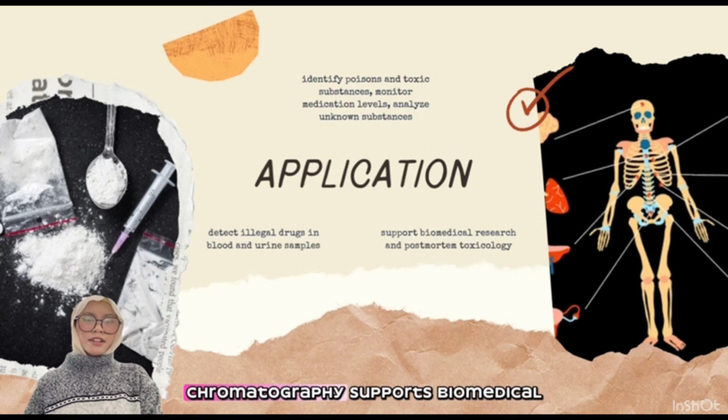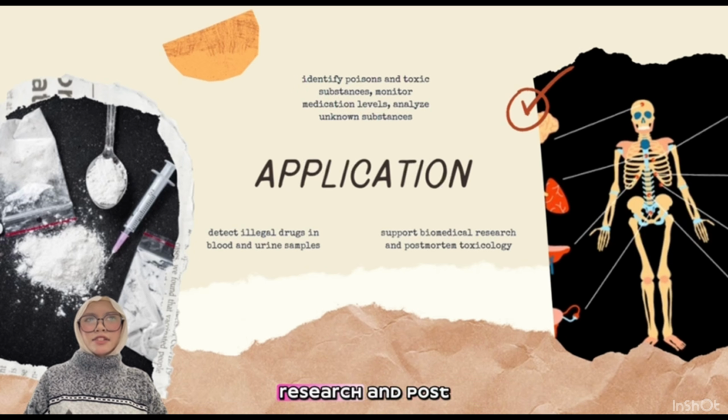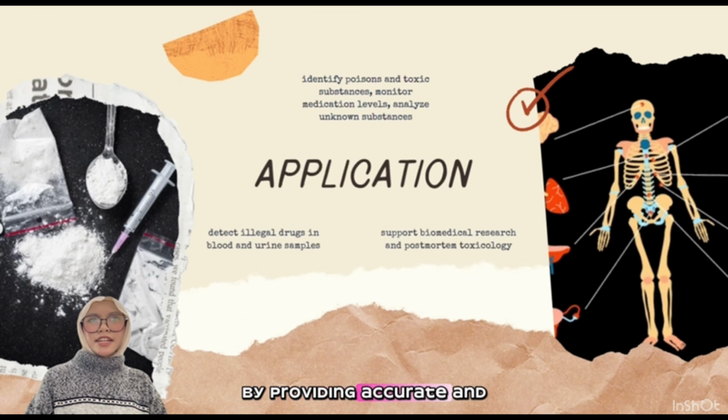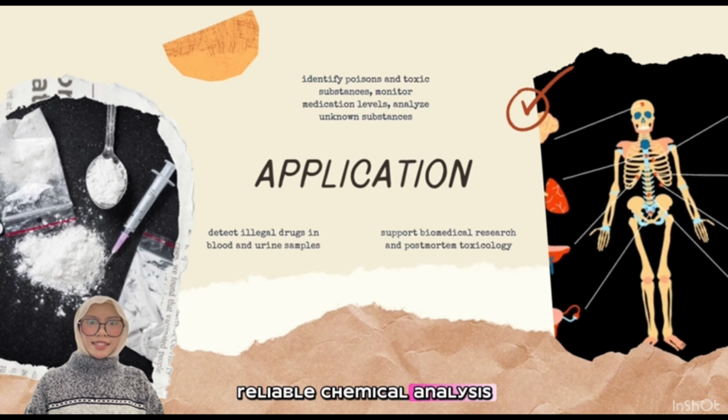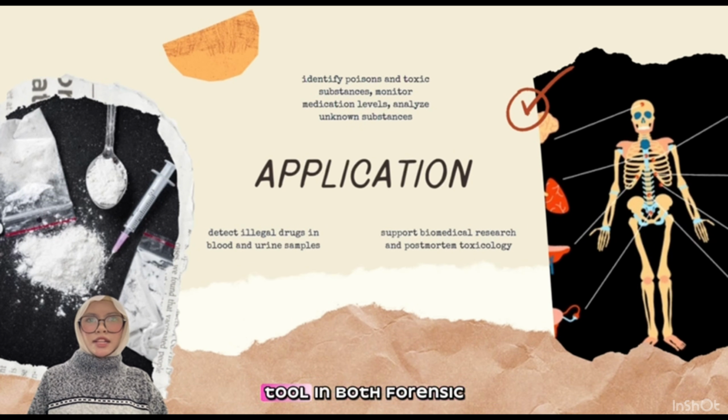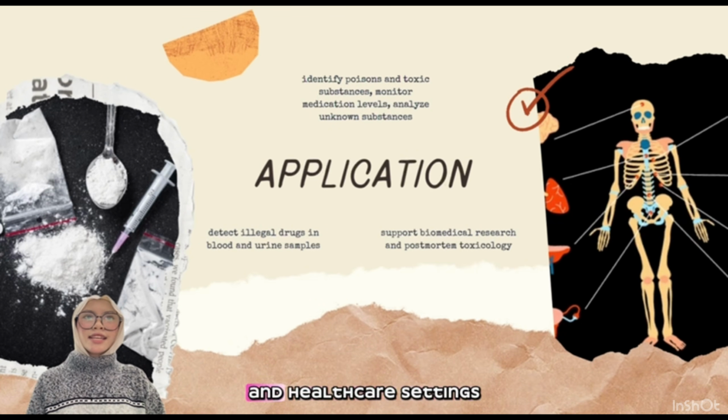In addition, chromatography supports biomedical research and postmortem toxicology by providing accurate and reliable chemical analysis. This application makes chromatography an essential tool in both forensic laboratories and healthcare settings.